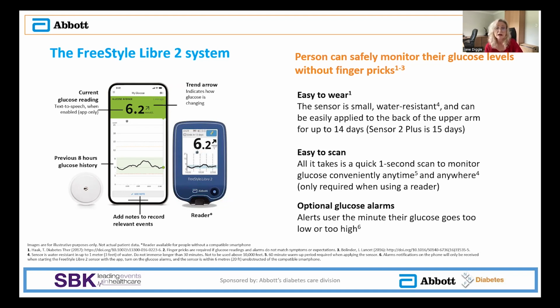And what you see on either of those screens is the current glucose level. And also you see an arrow on there, which is showing you the speed at which that glucose level is changing, whether it's going upward or downward or stable. And we're going to talk a lot more about that in this series of webinars. So if we move on to the next slide.